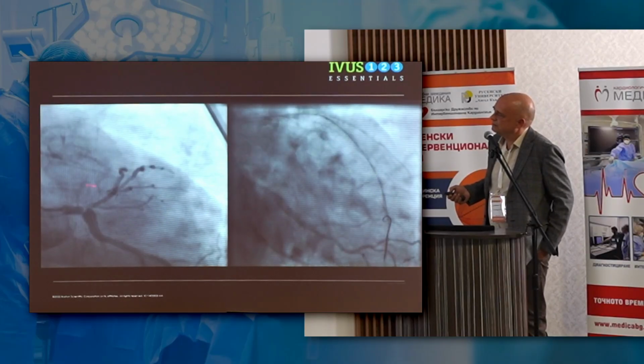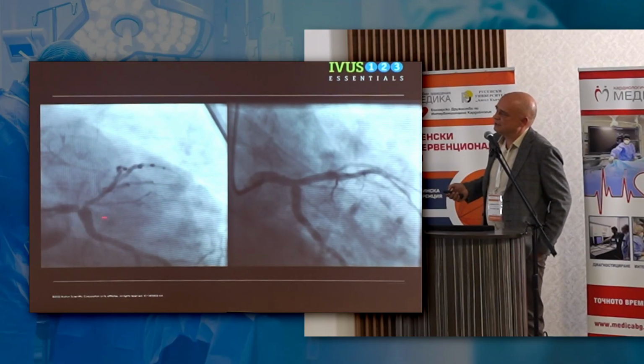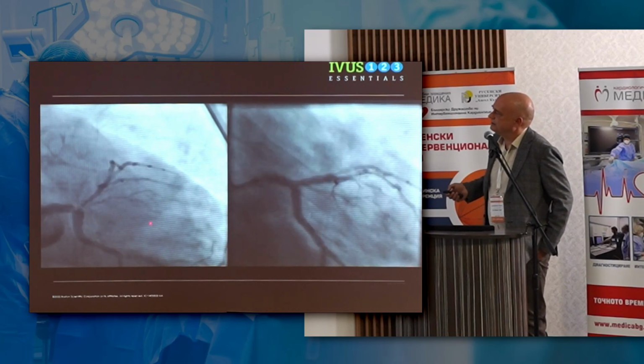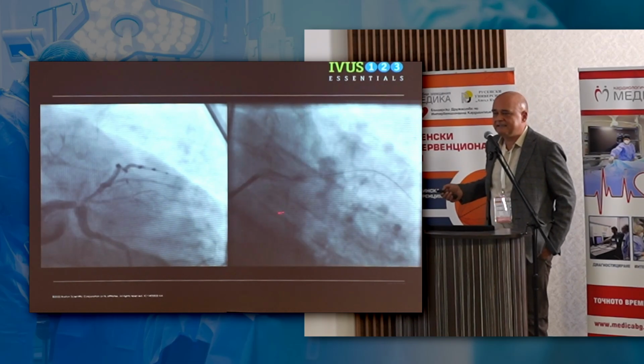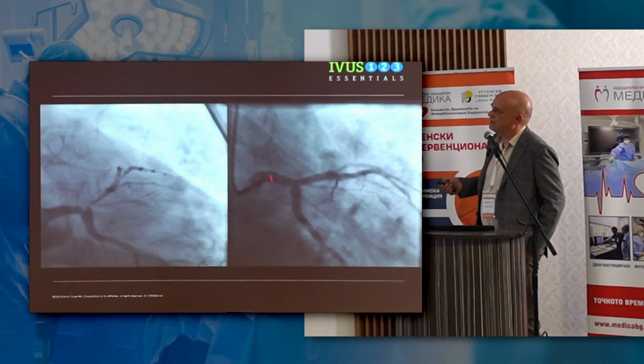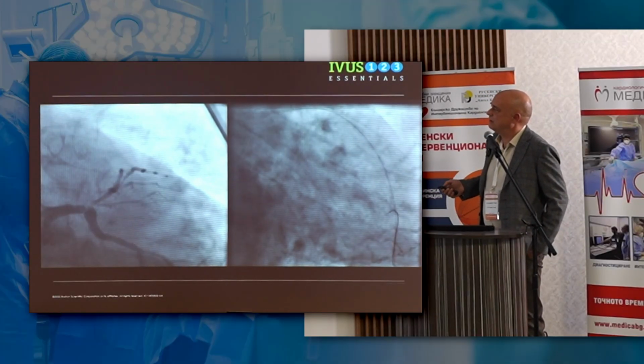Also here, it is a very complex lesion with a possibly very big problem to wire the LAD. And these cases were treated only with plain balloon angioplasty and without IVUS.